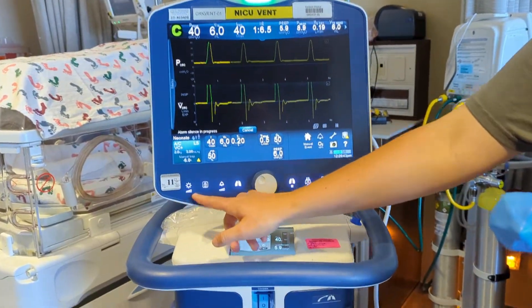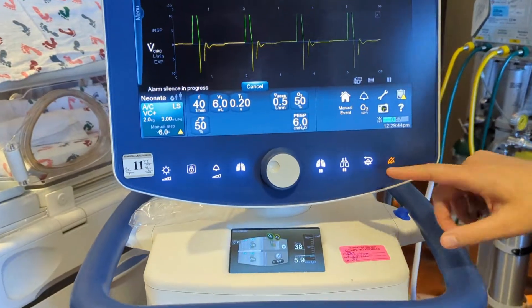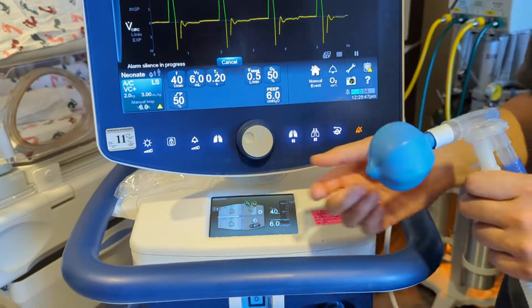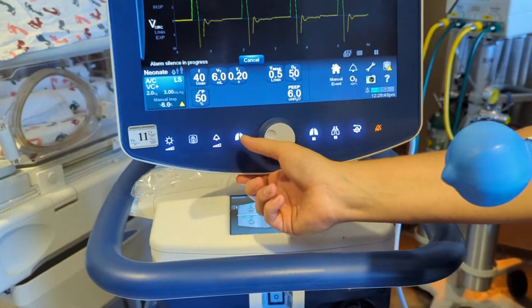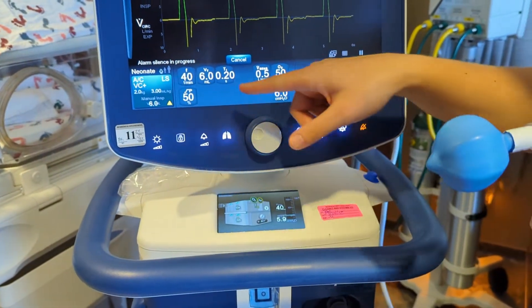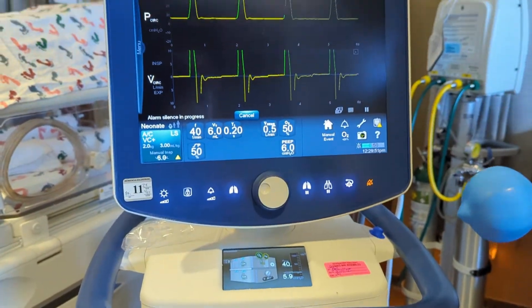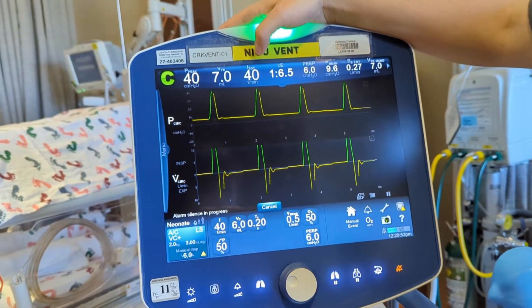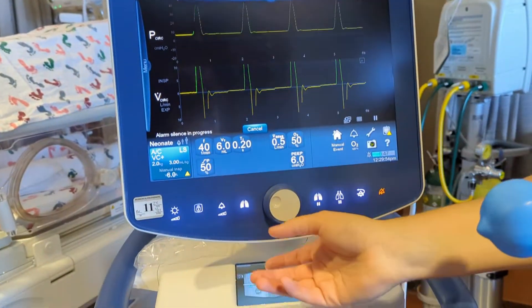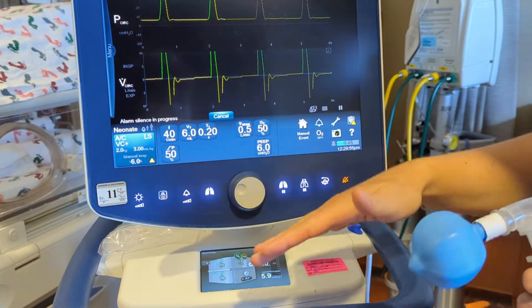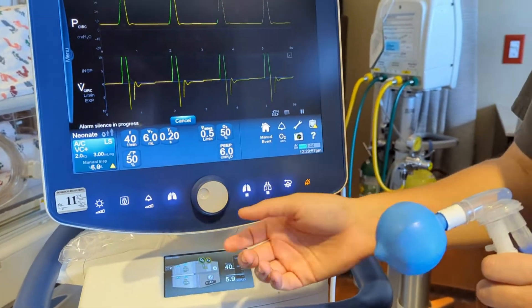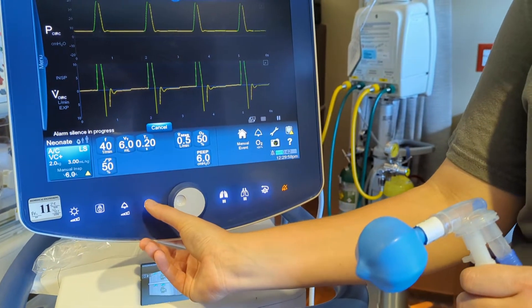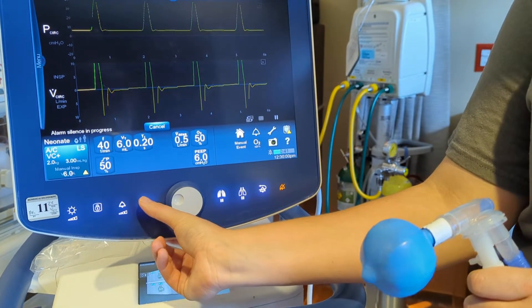Down in this area are our hard keys. One you'll want to be familiar with is the manual breath button. Right now we have a rate set at 40 and the baby is receiving 40. But in the case that you're weaning down the respiratory rate and the baby starts to go apneic, you just give that manual breath — push that button.